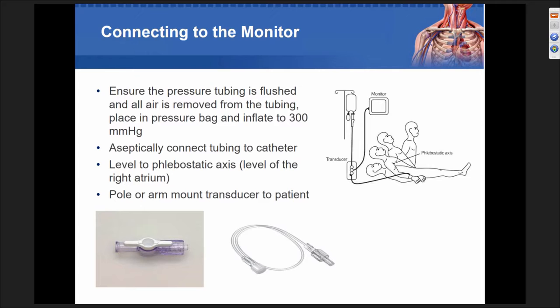So what we do is we add a 6-inch piece of high-pressure tubing, and it has to be high-pressure tubing because it's the arterial system, and a one-way stopcock. And I want you to focus on this one-way stopcock for just a second. This one-way stopcock connects the tubing to the transducer tubing. The tubing connects to the arterial catheter that's indwelling in the patient. And for me as an inserter, this allows me to dump these 2 sterile components on my sterile field and sterilely attach my tubing and then hand off that one-way stopcock to the person waiting with the transducer. This also allows the cycle time of transducers to be changed every 4 days without breaching my dressing or having to go down to the insertion site to change the tubing.